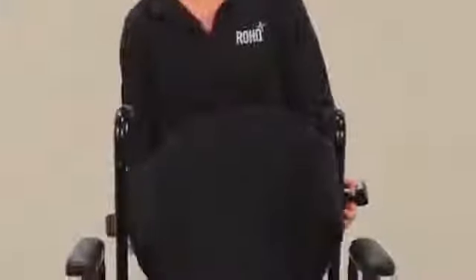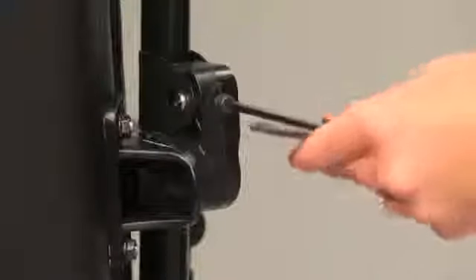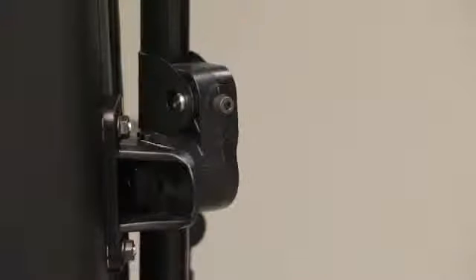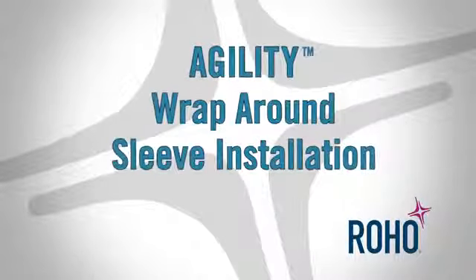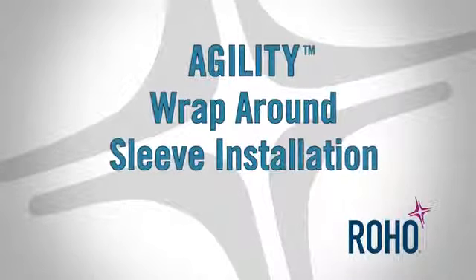Or, if possible, you may find it helpful to have another person hold the back while wrapping the bands around the wheelchair back canes. Measure the height of both back cane bands with a tape measure and adjust as needed to ensure they are level. Tighten the back cane hardware bolts with an Allen wrench until snug, plus a 1/4 turn. Your installation is complete.